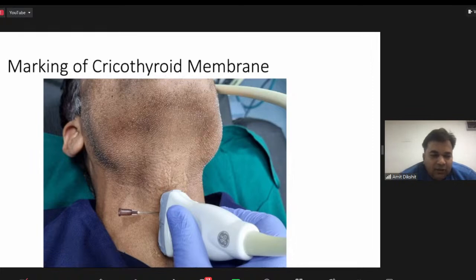And then, as we know, the 6.5 universal connector and Ambu bag. As we punctured and placed a 16 gauge cannula there and removed the stylet, we have even done some amount of spraying with 2% lignocaine and some topicalization. So as we are able to attach the Ambu to that and do some oxygenation, it has provided us a little additional 10-20 seconds to complete our awake fiber optic intubation drill in sitting position.